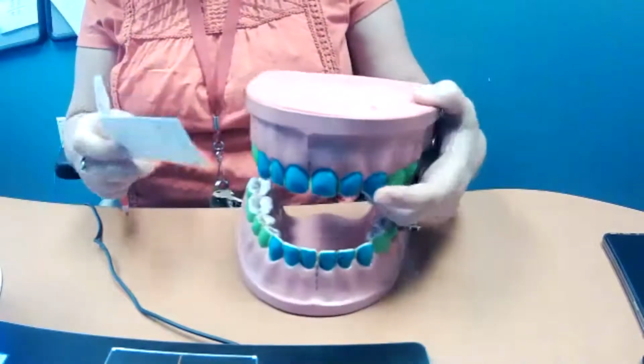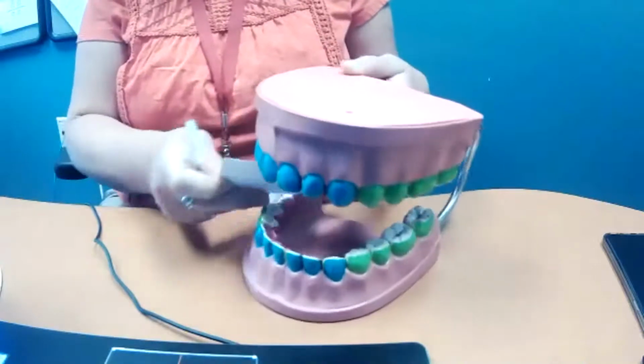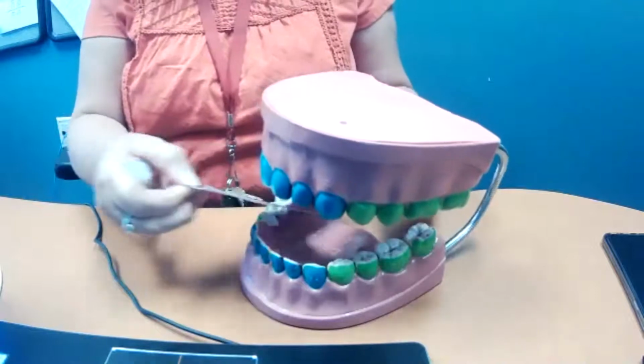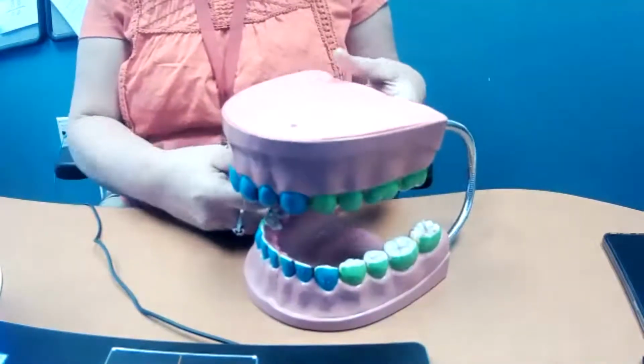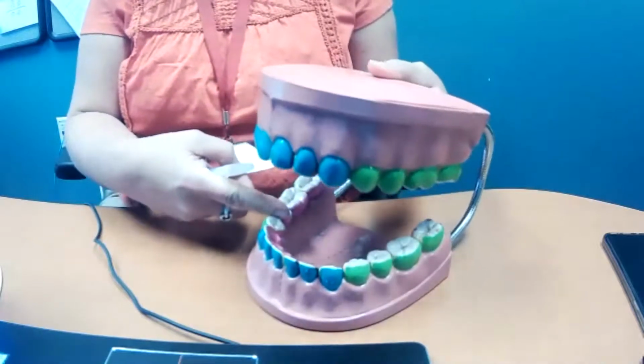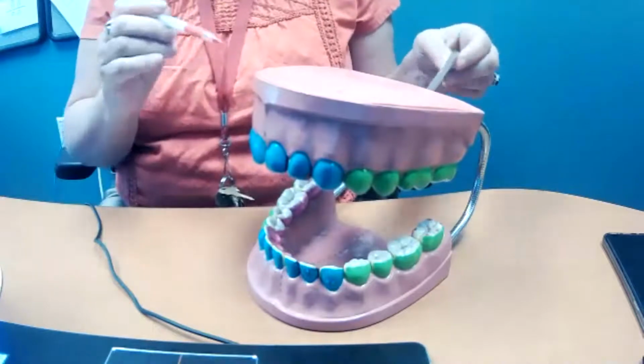So some things that can happen that way also is that, now when we put the film in the patient's mouth, I guess I wasn't very prepared here. I wasn't going to do this, but some things that can happen also is your vertical positioning, right?